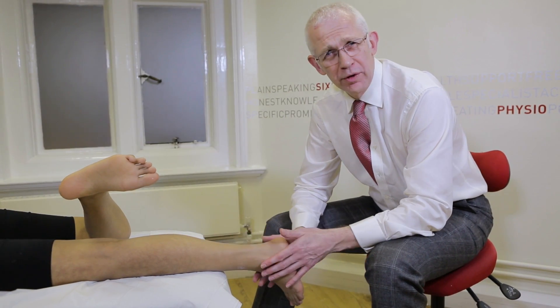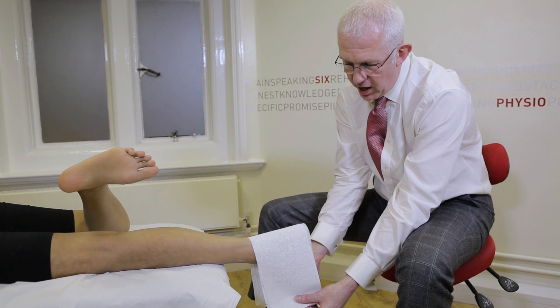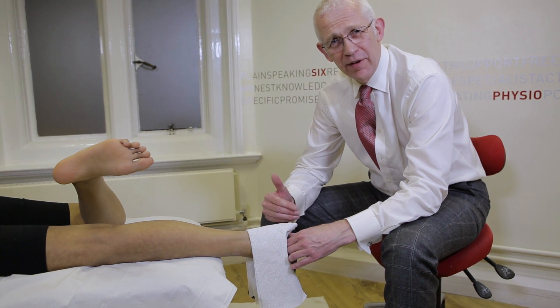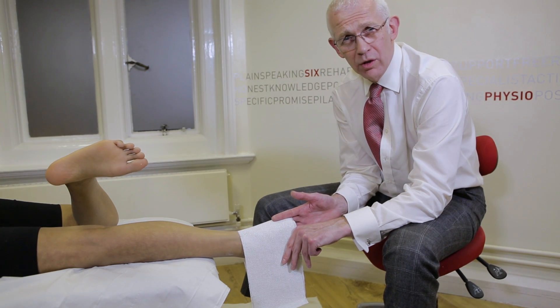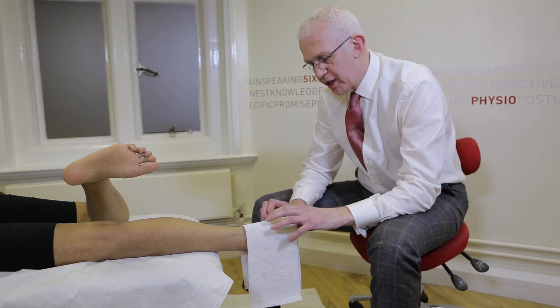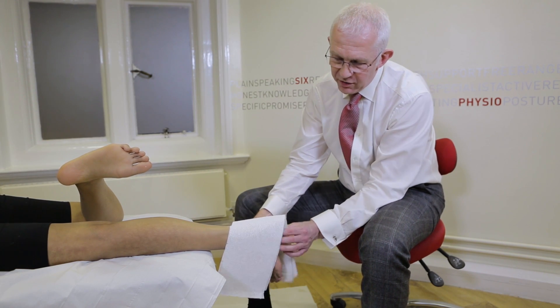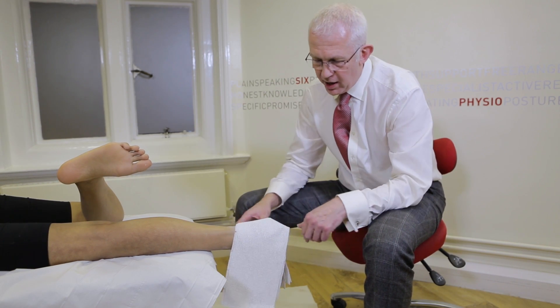Different people have different techniques. I tend to use three layers of plaster of Paris, and my markings for length go from the distal aspect of the hallux to the fifth metatarsal, so it goes all the way around the foot in one go. One of the problems you can get when you take a cast like this is that as you fold the material it creases, which can affect the quality of the inside of the cast. So a little technique we do is to cut the plaster of Paris material at this point — you can do that before you cast or after you've put the wet plaster of Paris on. We'll show you how to do it once the plaster of Paris is on the foot. The other aspect to consider is where the plaster of Paris crosses over underneath the foot. What I tend to do is have one thickness all the way over the sole of the foot, then fold across, so we don't get a line of the junction in the middle of the cast.